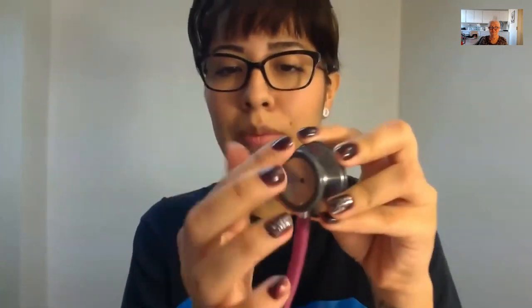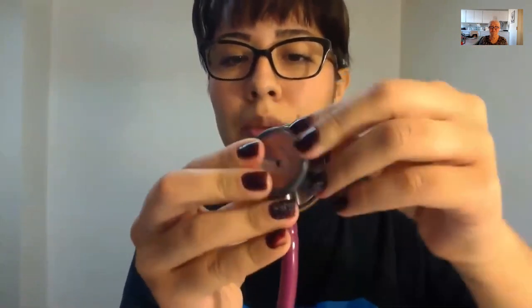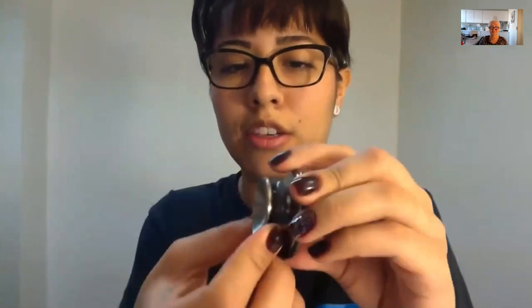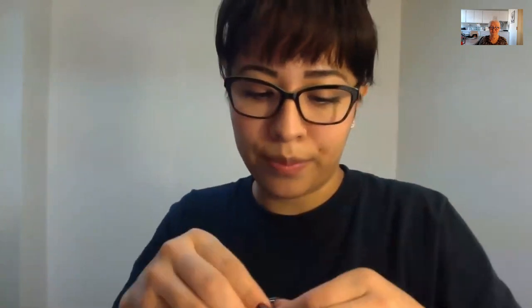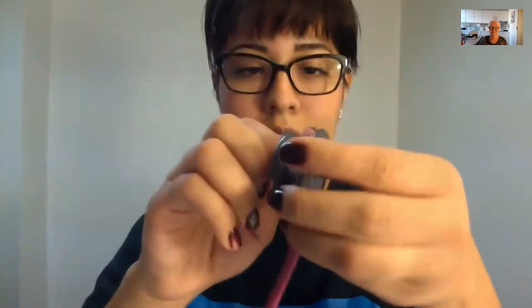and just wipe it down. You can also push this little plastic or rubbery piece back and clean behind there too. Let me tell you, it's a little bit hard to put this rubber back in, but it's not impossible. So you're more than welcome to clean behind this rubber piece, like I said.